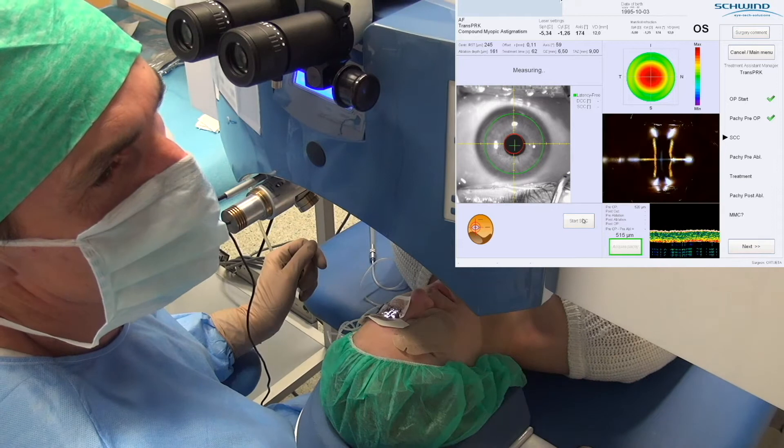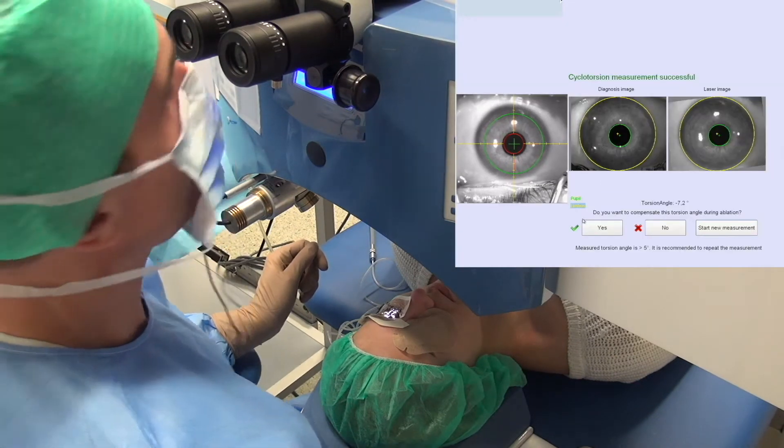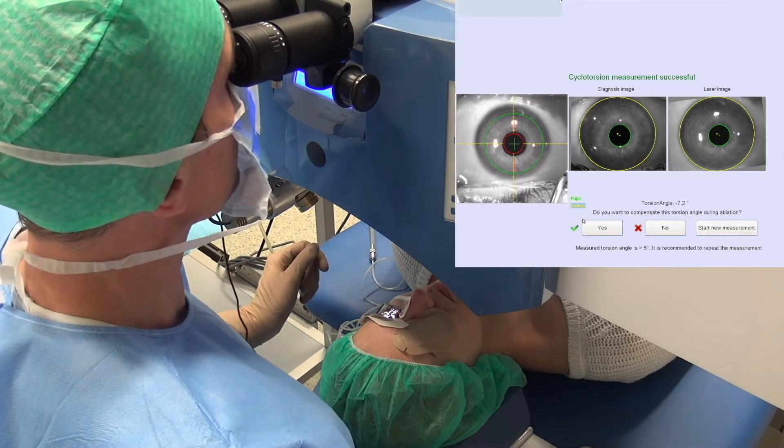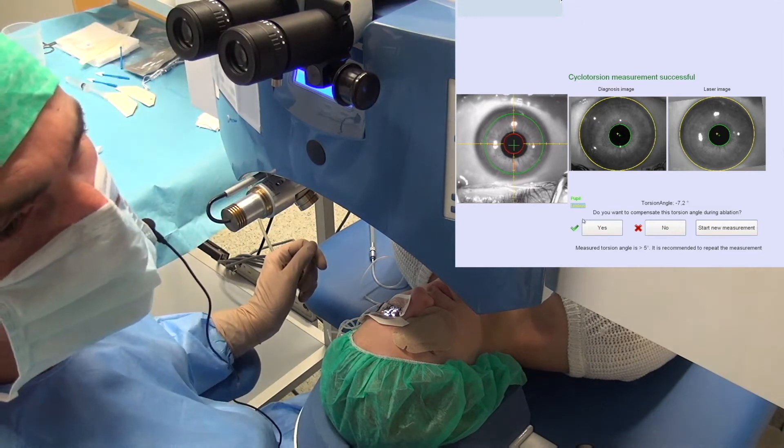In this case, as we measure more than 5 degrees of static cyclotorsion, we repeat the measurement.